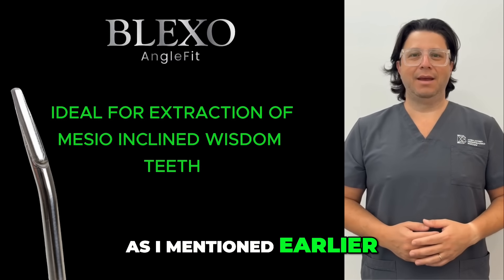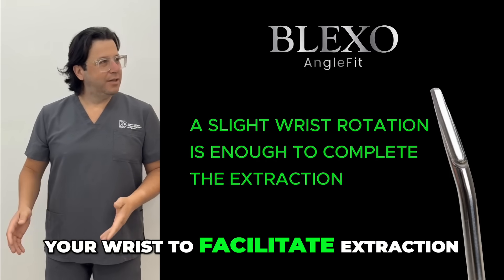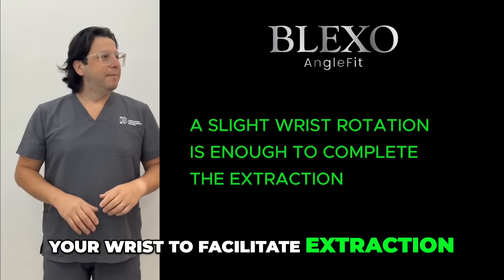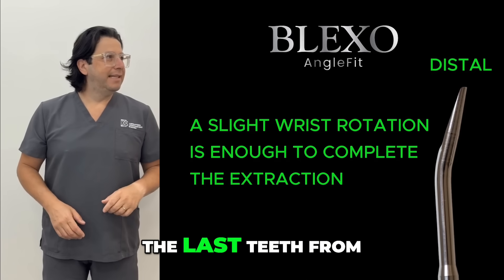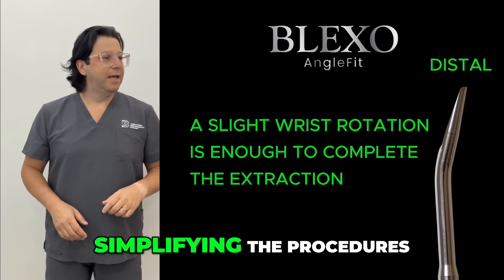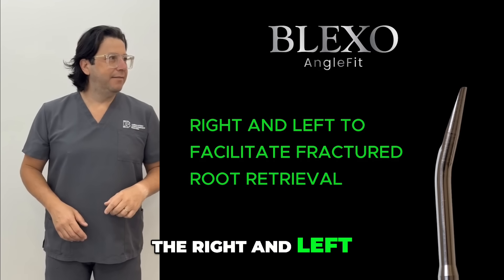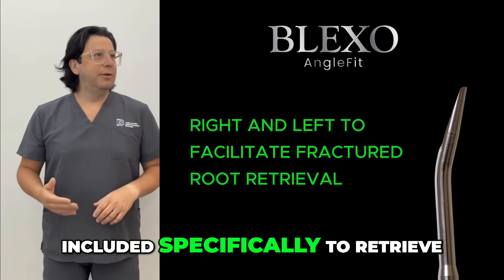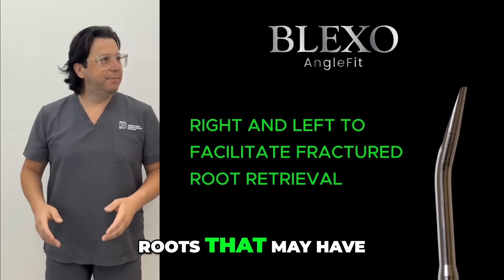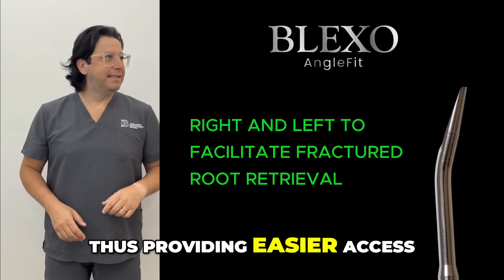Once the tip has penetrated, you can rotate your wrist to facilitate extraction. The same goes for the distal angle, which allows you to approach the last teeth from the distal side, simplifying the procedures. In particular, the right and left angulations have been included specifically to retrieve roots that may have fractured deep within the sockets, thus providing easier access.